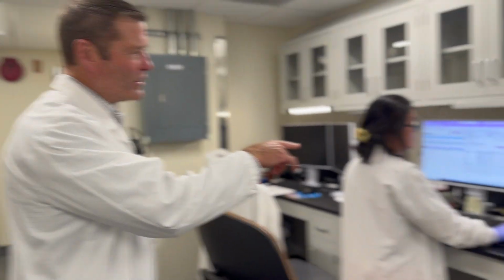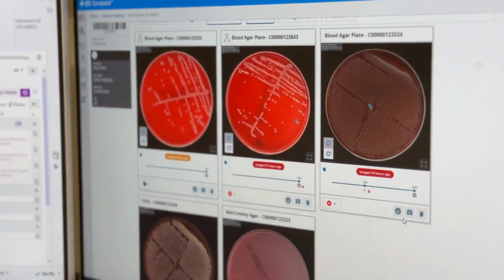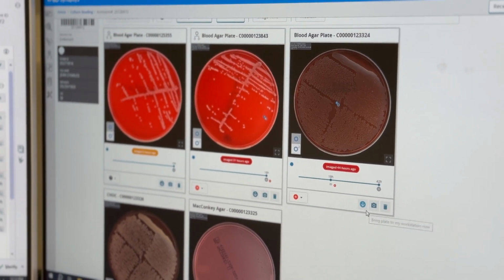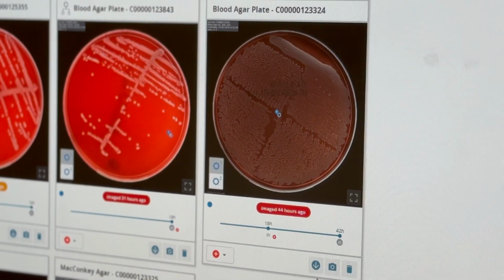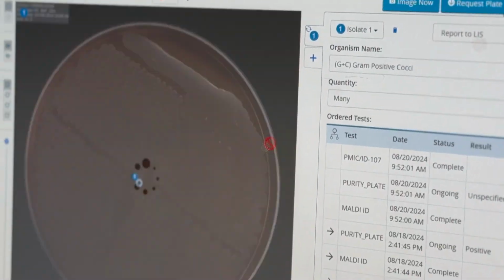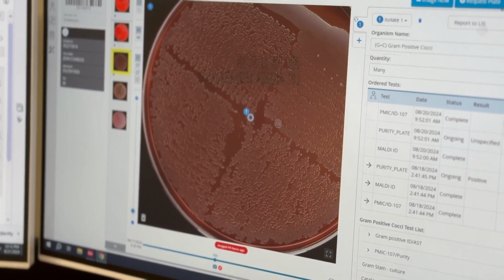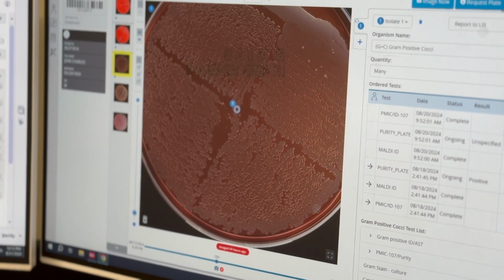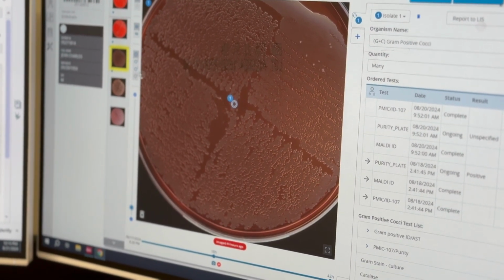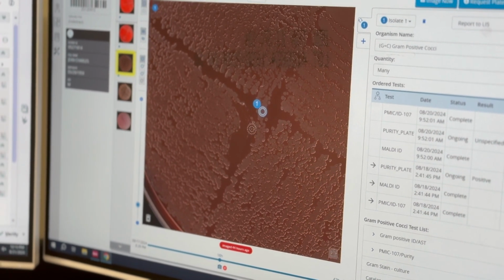What you can see over here on the right-hand monitor is all the plates that belong to this culture. You can see a blood plate, a chocolate plate, a MacConkey agar, and each of those plate types is inoculated with this specimen. If we zoom in on one of these, you can see that the plate is divided up into 4 quadrants. Again, the organism was plated here with a ball bearing. And then you can see that there are some isolated colonies there. Arlene has now circled one of those colonies with a number 1, and that's going to be worked up further.